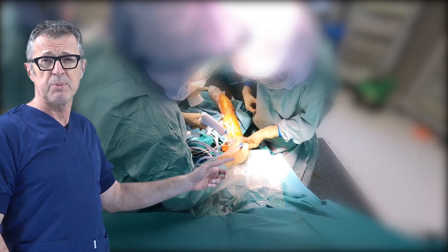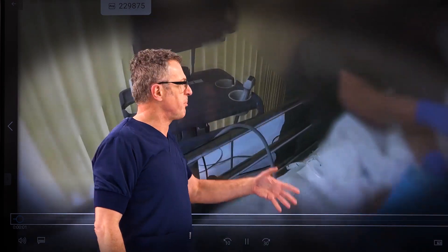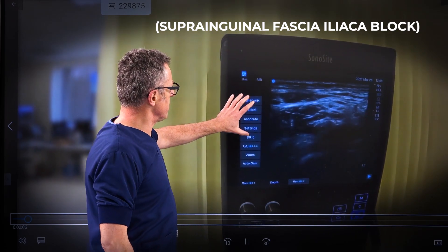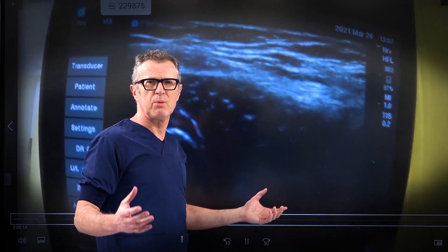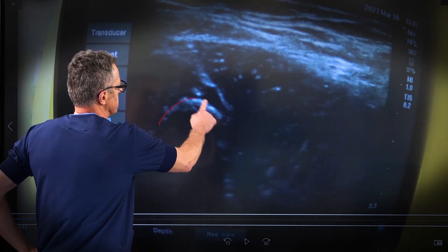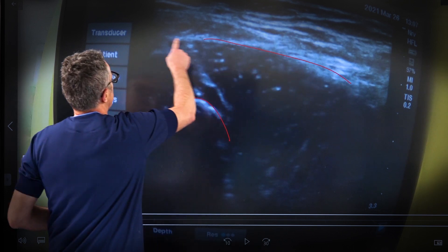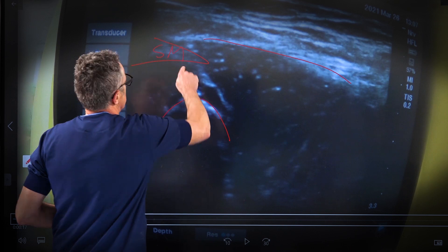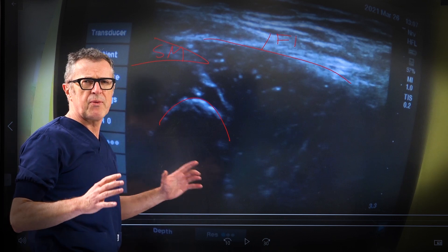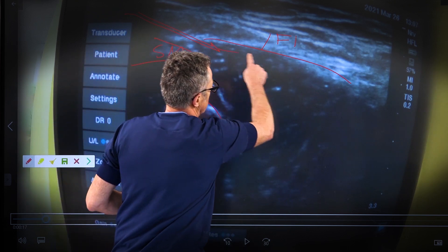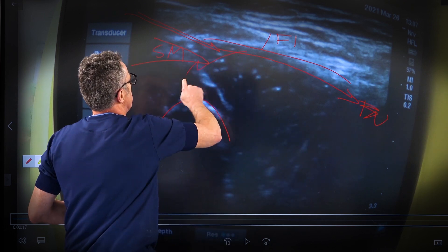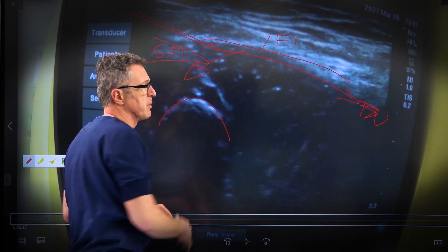Let's watch the video of these procedures as we teach one of the assistants to become competent in regional anesthesia. The patient is in a supine position; we have just released the traction on the hip and are visualizing the fascia iliaca. To perform the suprainguinal fascia iliaca block, you want to visualize the anterior inferior iliac spine. We can see the anterior inferior iliac spine, the fascia iliaca, a sliver of the sartorius muscle, and the principle is to inject local anesthetic underneath the fascia iliaca so it spreads towards the femoral nerve, lateral femoral cutaneous nerve, and proximally towards the lumbar plexus.